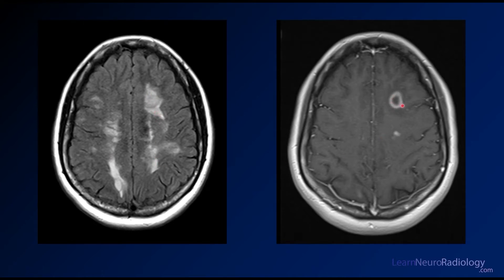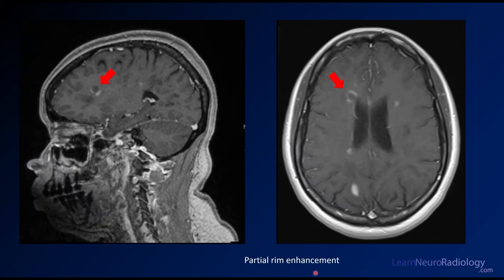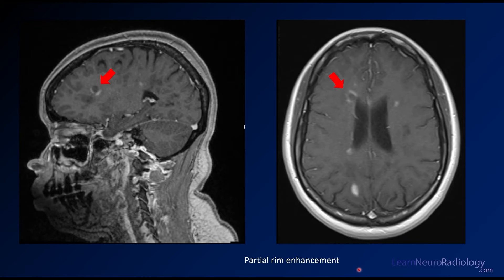On post-contrast, you see these ring-enhancing lesions, plus a couple of little dots of enhancement. If you look at the other projections, this is something quite common you need to be familiar with — what we call an incomplete rim of enhancement. This lesion has peripheral enhancement, but it doesn't go all the way around; it's a sort of broken rim. This is almost classic for demyelinating disease. So when you see that — even if it's big and mass-like, looks like a tumor — think about tumefactive demyelination.